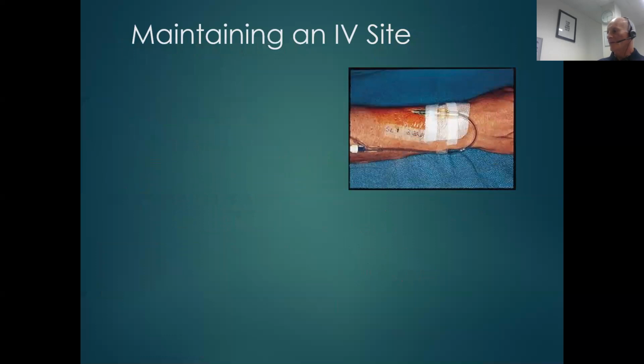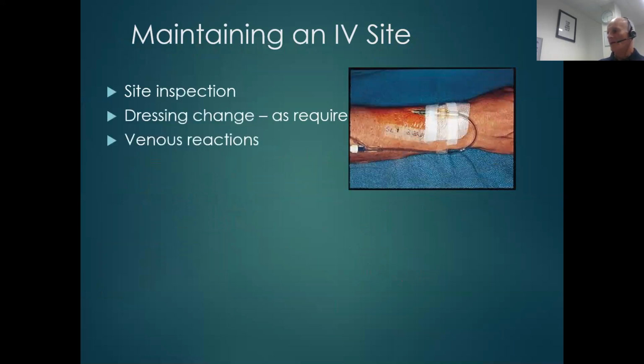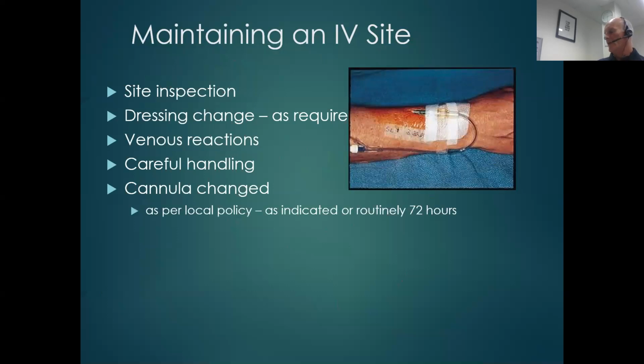Okay, maintaining the IV site: inspection, dressing change as required, venous reactions, so we want to make sure we're having a look and monitoring the patient. Careful handling, cannula changed, which again will depend on your local protocols, and some routinely change at 72 hours, some at 48, but we don't want to keep sticking a patient if we don't need to and everything's aseptic.